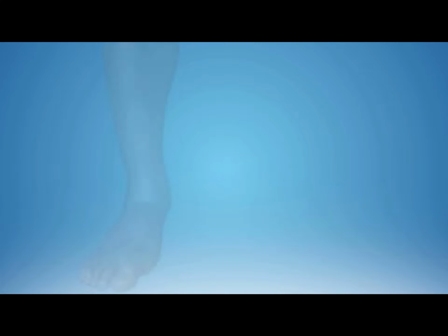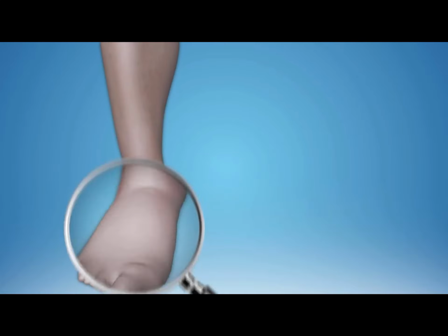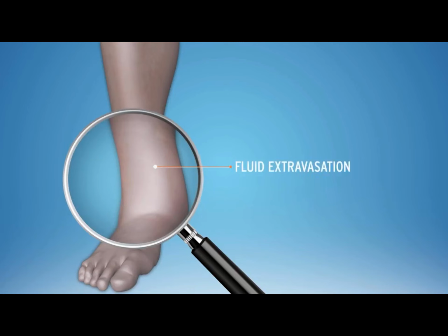Complications. The most common complication of the intraosseous needle insertion is fluid extravasation resulting from through-and-through penetration of the bone, or maybe from the incomplete insertion of the needle. In the case when an extravasation occurs, the needle should be removed and pressure has to be applied on the site.